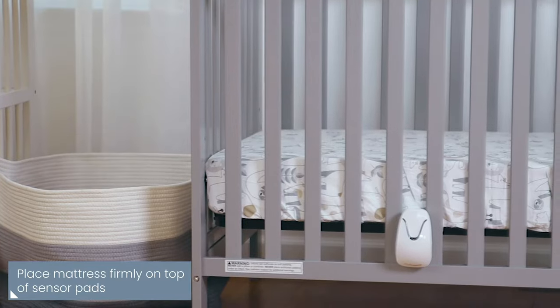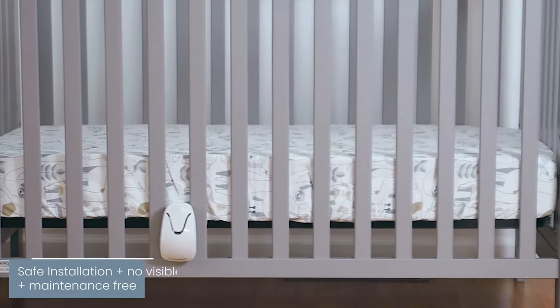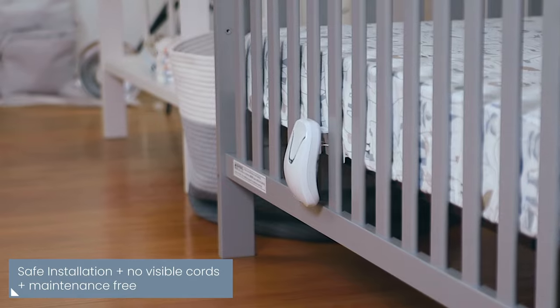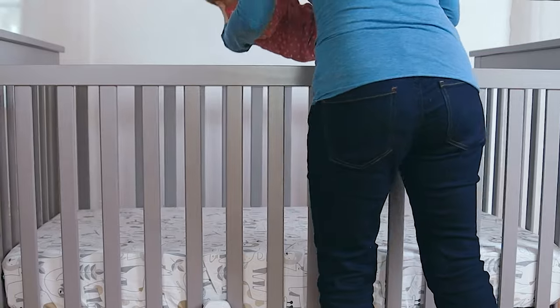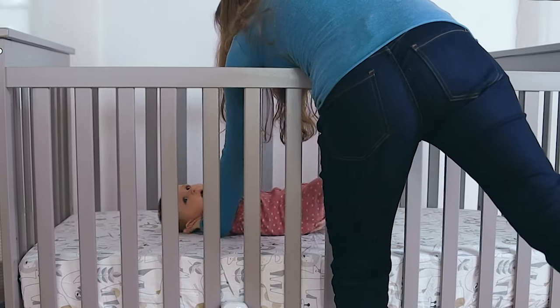One-time installation — that's it, it really is that easy. With no visible cords and no direct contact with your baby, you can be sure your baby is safe. Your baby won't even know the monitor is there.